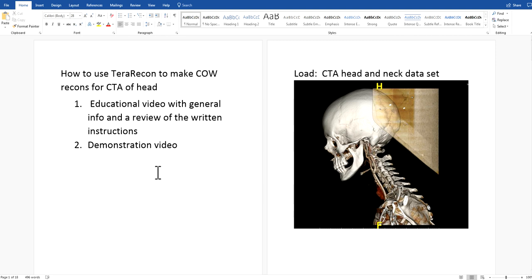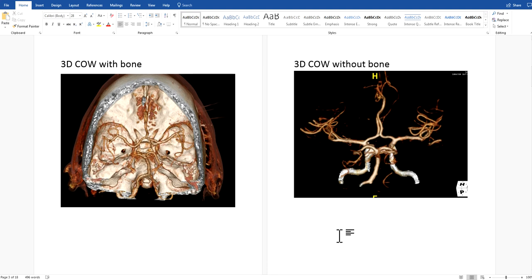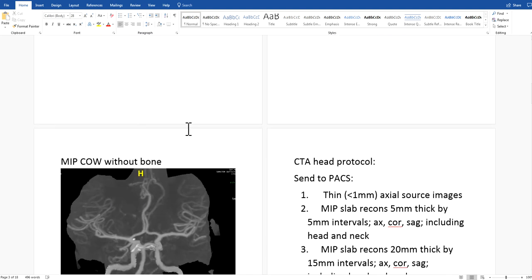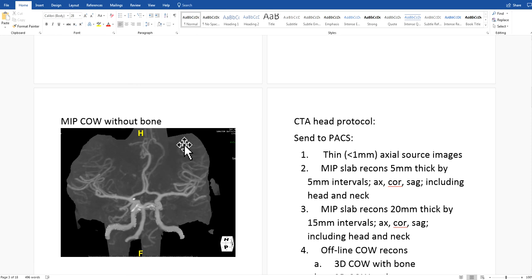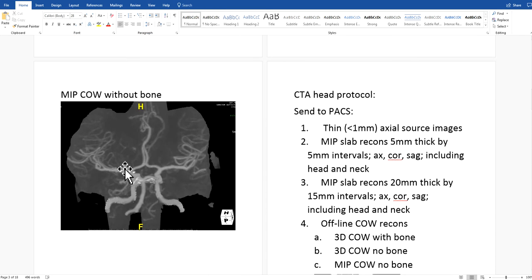So first we're going to talk about how you load a CT angiogram head and neck data set and make it into COW reconstructions and send them to PACS. We're going to be making 3D COWs with bone with the skull base on, a 3D COW without bone, and a MIP COW, which is the same as the 3D but changed to MIP type display.